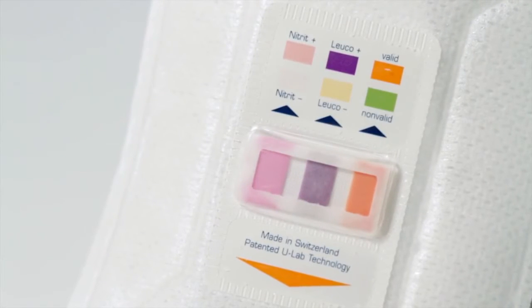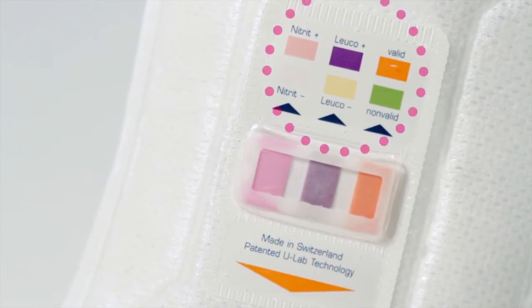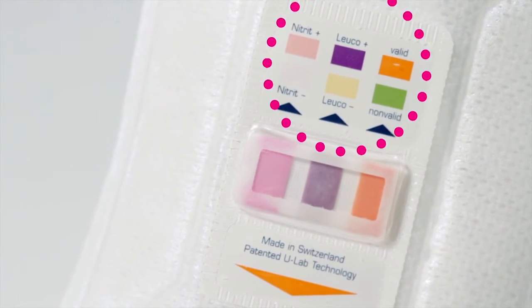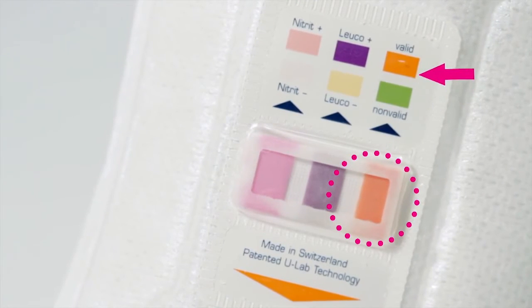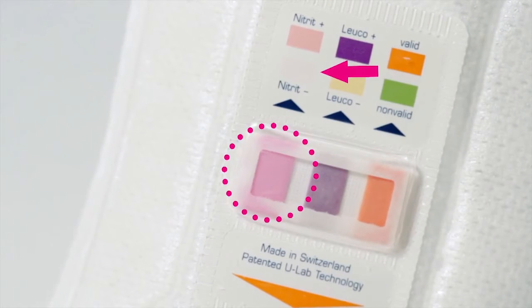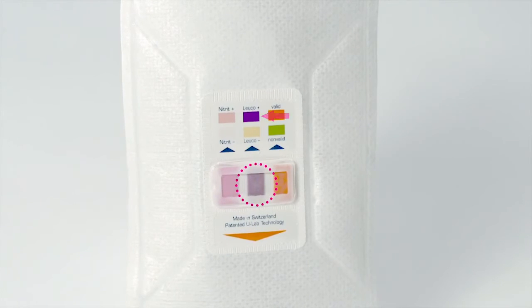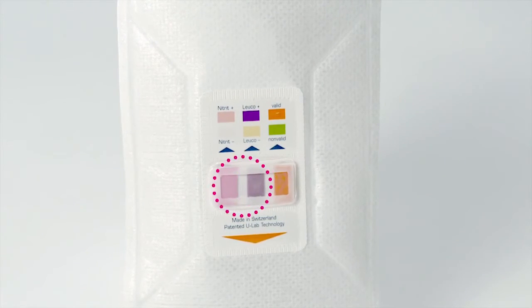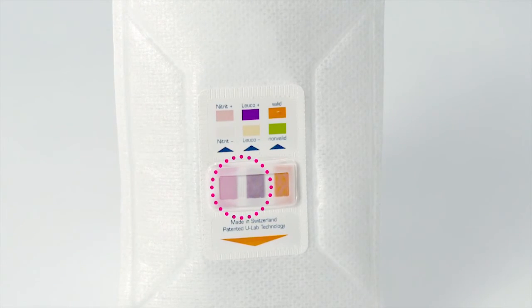Read the results of TENA U test. Compare the test fields in the reaction chamber with the reference colours printed on the film above the reaction chamber. If the green indicator has turned orange, the test is valid. If the nitrite indicator changes from white to pink or the leukocyte indicator from white to violet, the test indicates a urinary tract infection. If both indicators change, there is a high probability of a urinary tract infection.